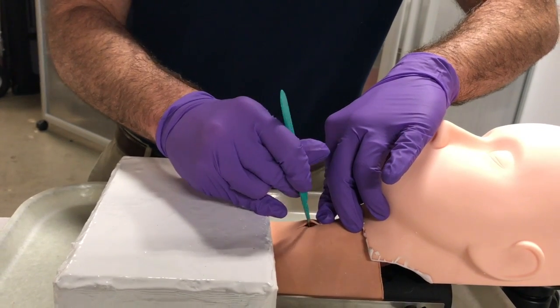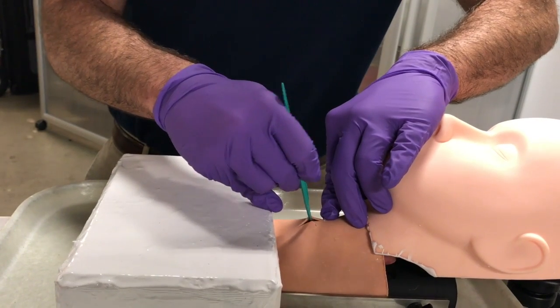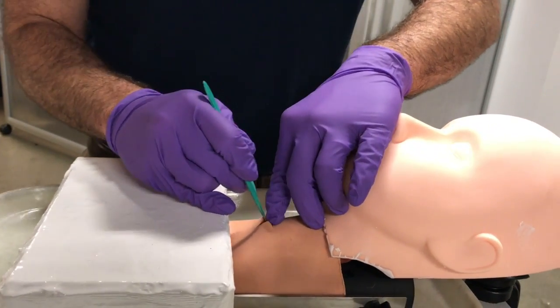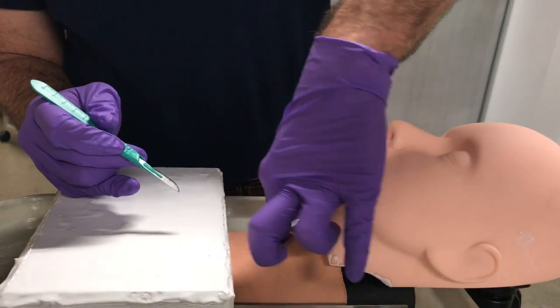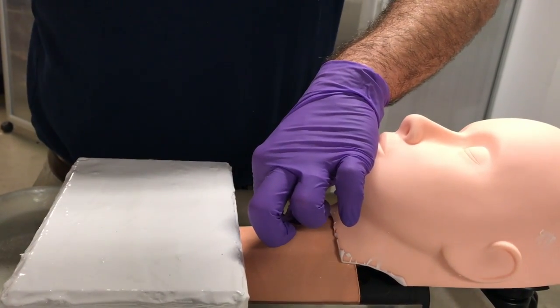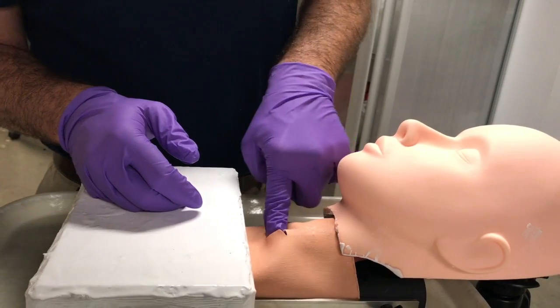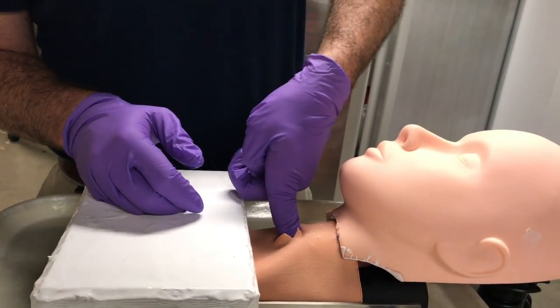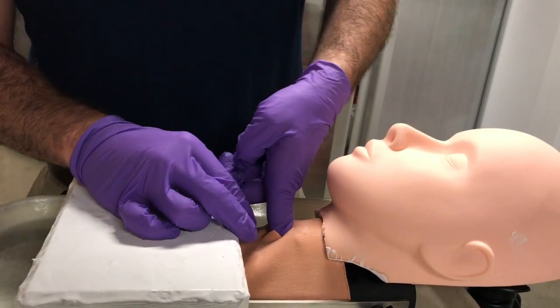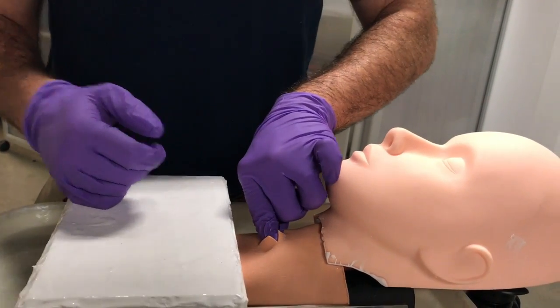You cut both directions with your scalpel across the membrane. The good news is that the way the cricoid cartilage is shaped, if you put your scalpel in too deep, you're not going to harm anything because there's a thick cartilaginous structure in the back of the airway at this point. Once you're in through the cricothyroid membrane, you can use either of your techniques for doing the cricothyroidomy.